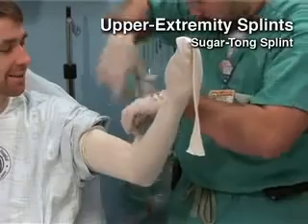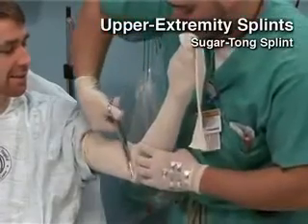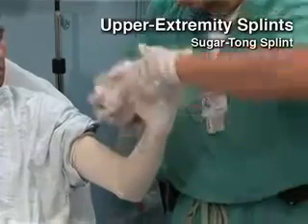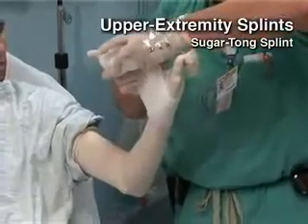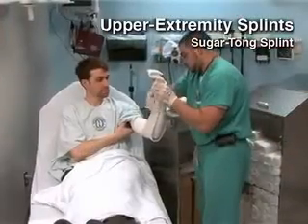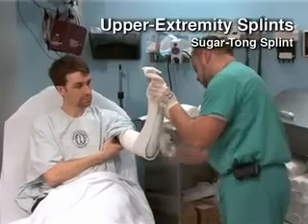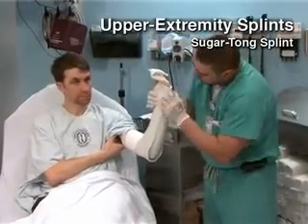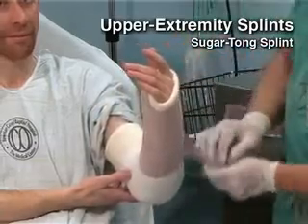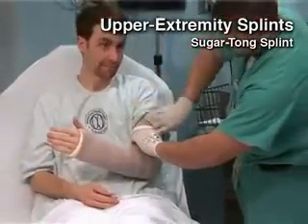A forearm sugar-tong splint is used for wrist and distal forearm fractures. It immobilizes the wrist and forearm and prevents supination and pronation of the forearm. The splint extends from the metacarpophalangeal joints on the dorsum of the hand, along the forearm, around the elbow, and back to the volar aspect of the mid-palmar crease. Place the elbow in 90 degrees of flexion while maintaining a neutral position for the forearm and wrist.